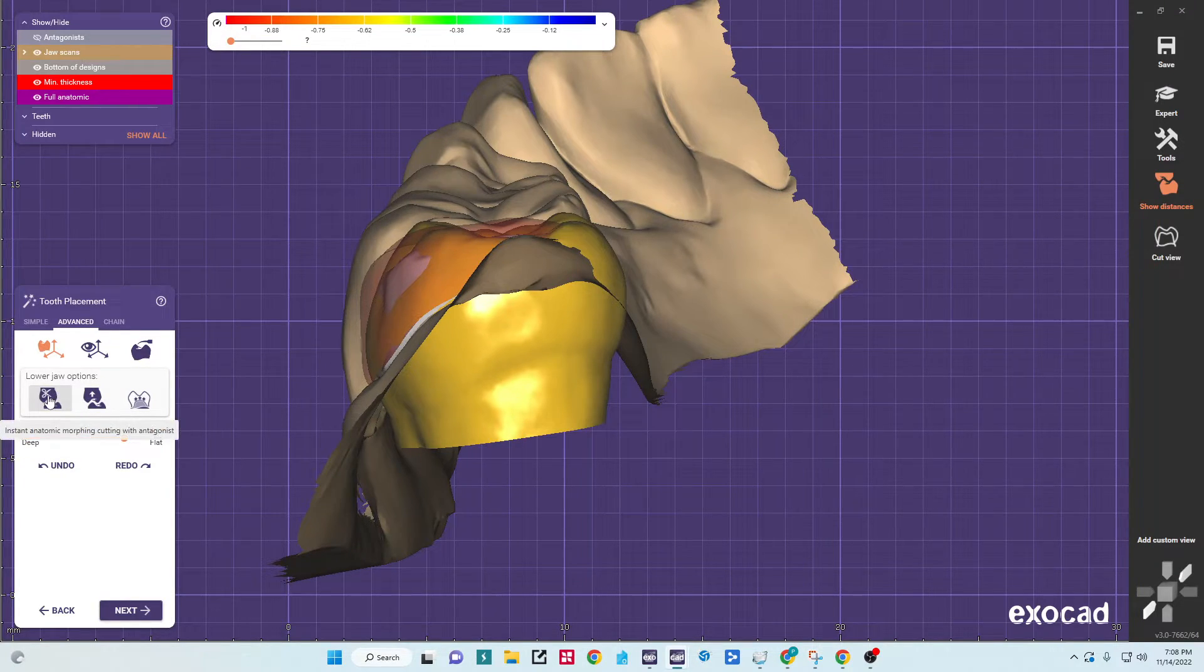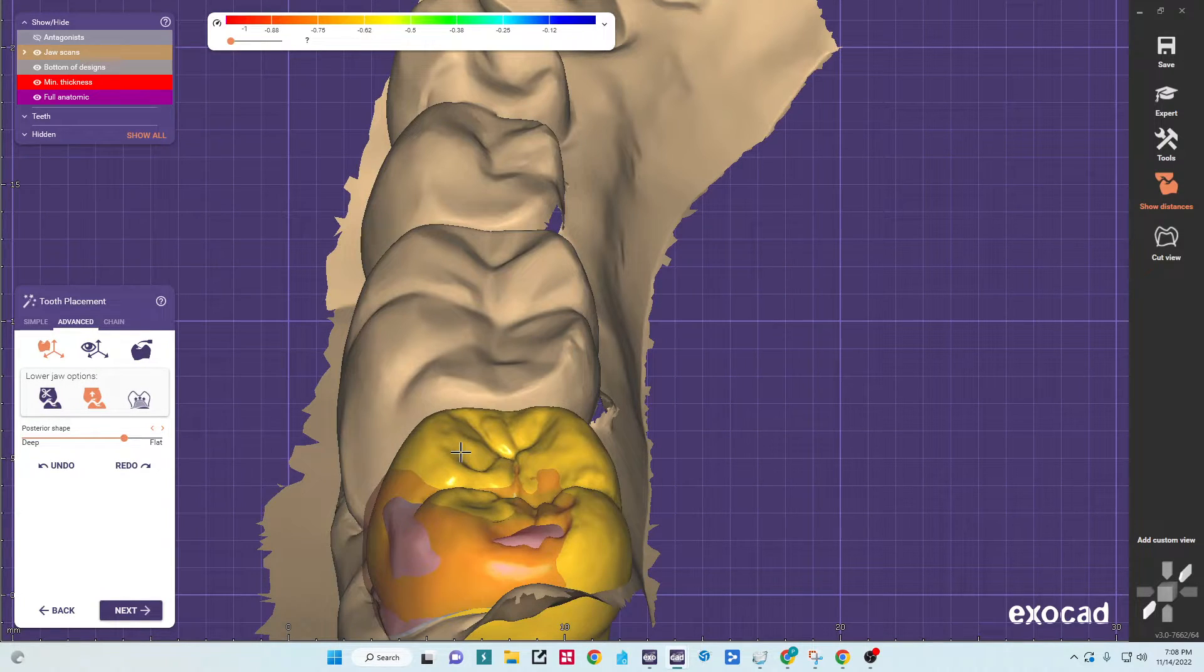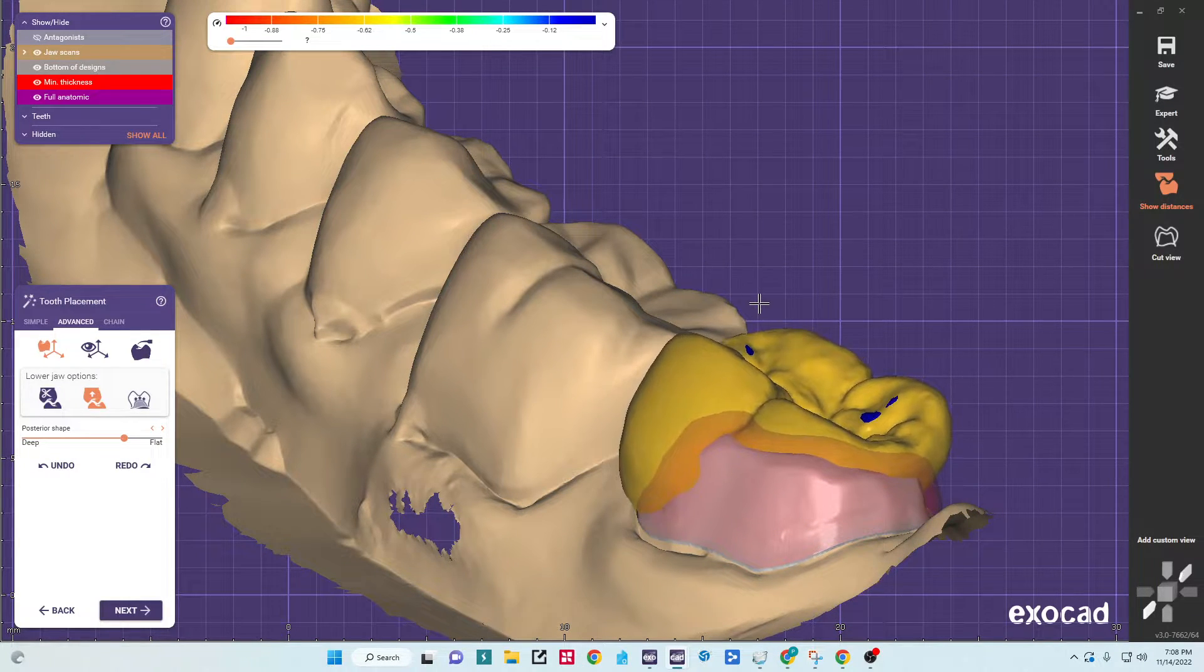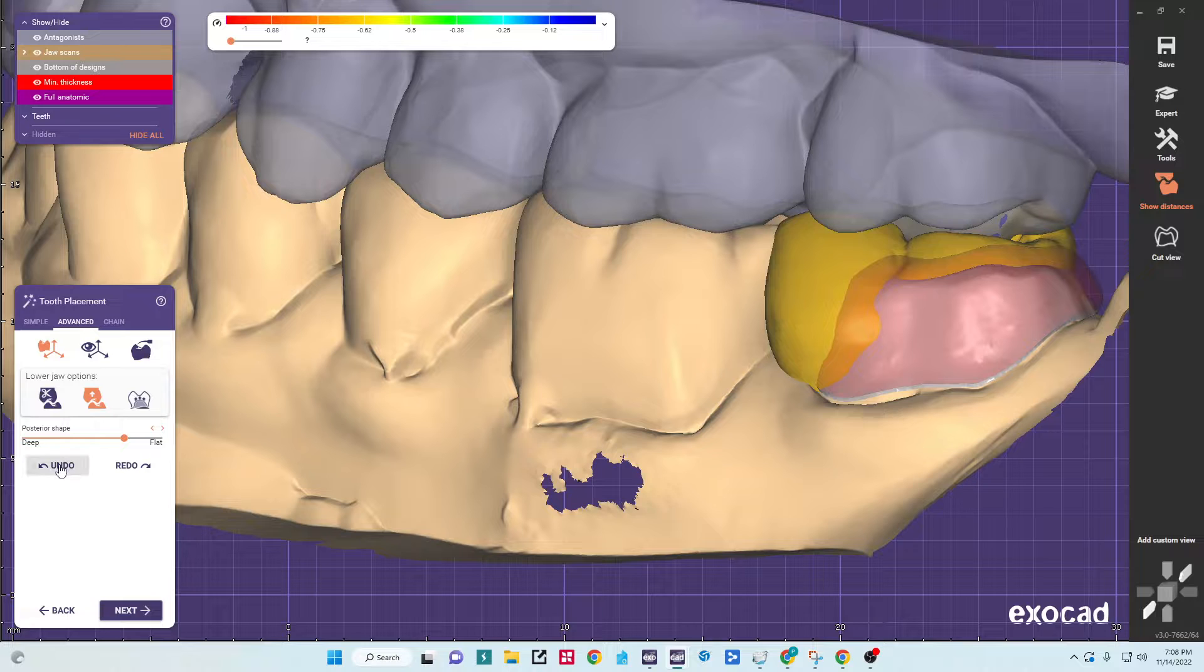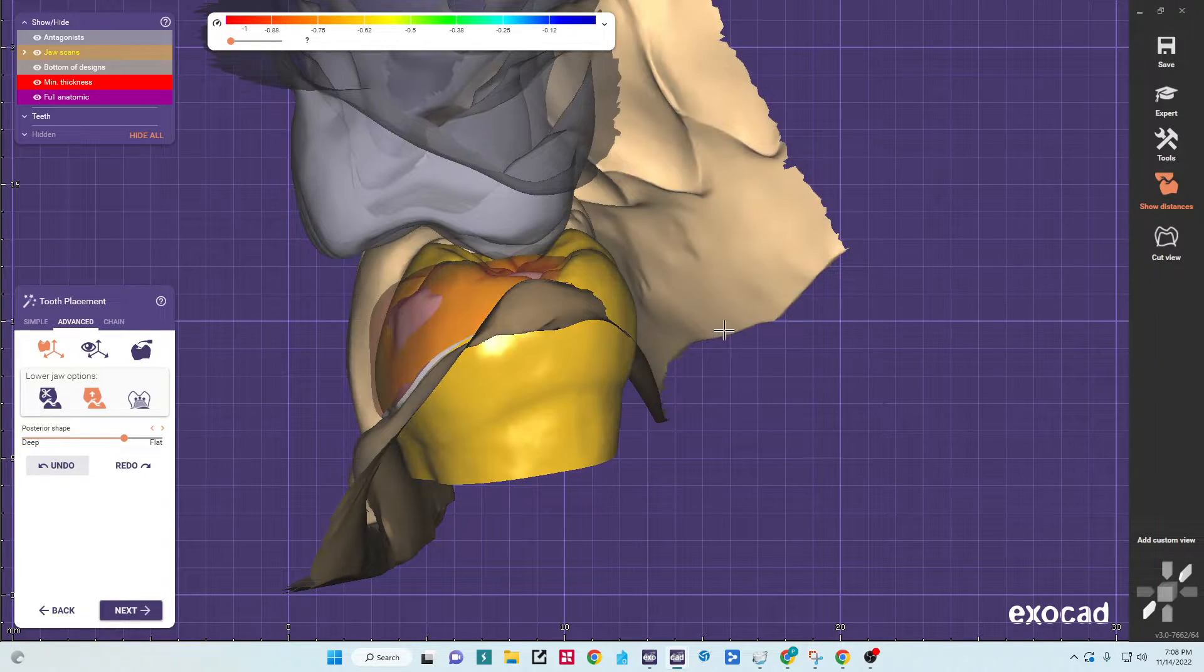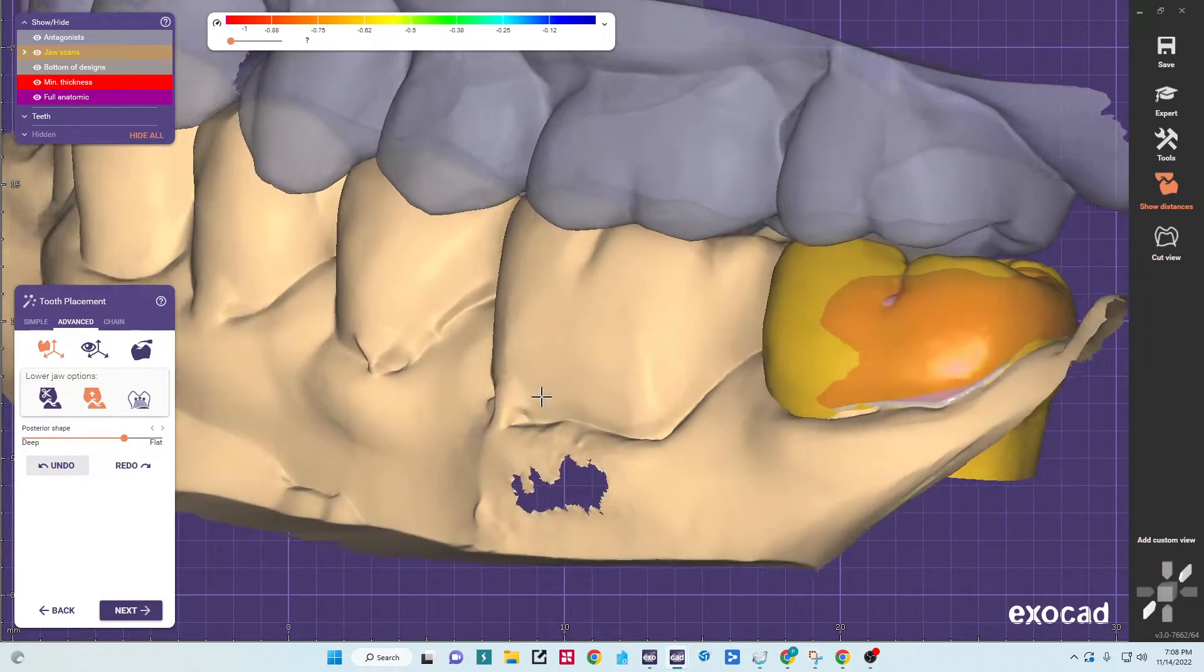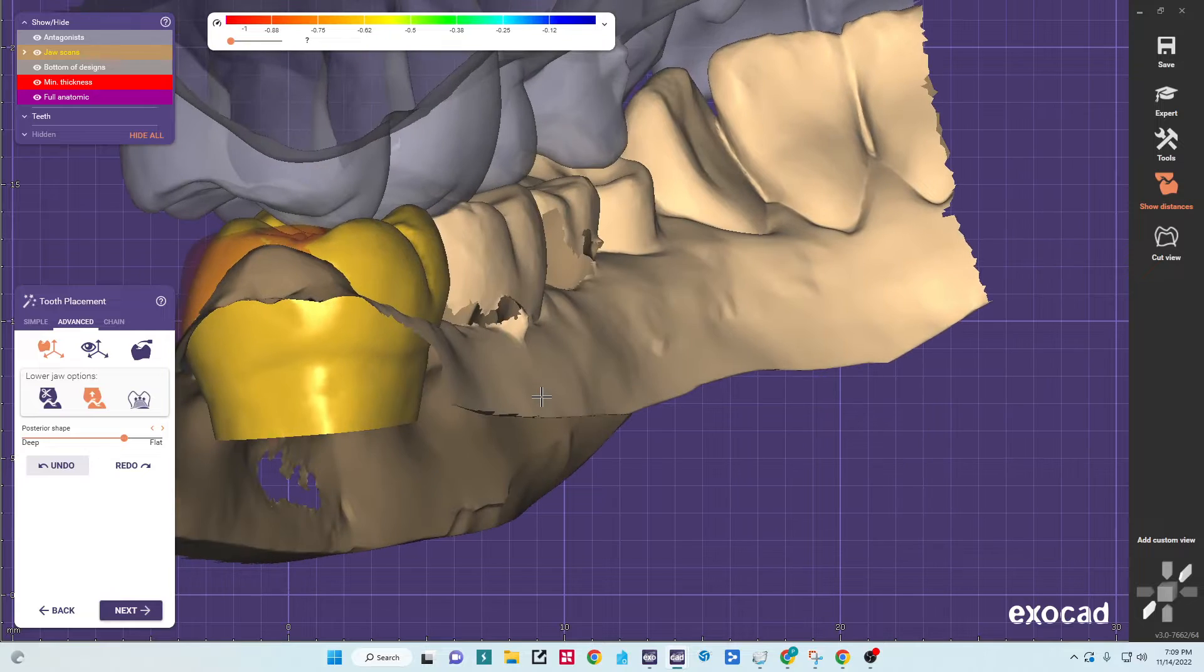And then the other options we have here is instant anatomic morphing to the opposing crown. So if you click on this and drag the crown around, it will actually cut the crown to the opposing. You can see as I drag it up, it won't allow me to occupy the same space as the upper arch. I'm going to undo that. But if I grab that and drag it just a little, you can see how it's going to automatically compensate for the occlusion, which is also a nice tool.